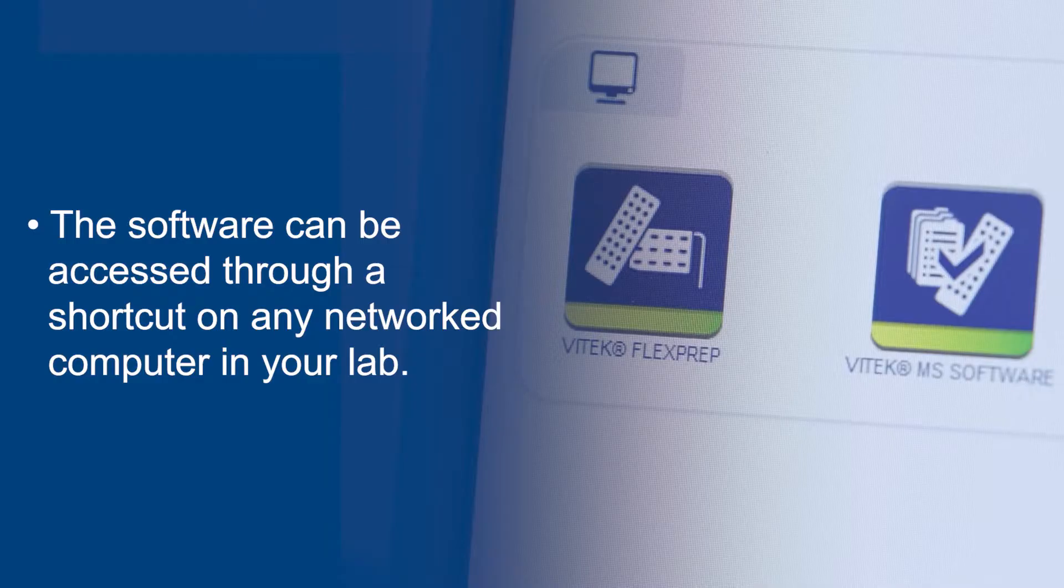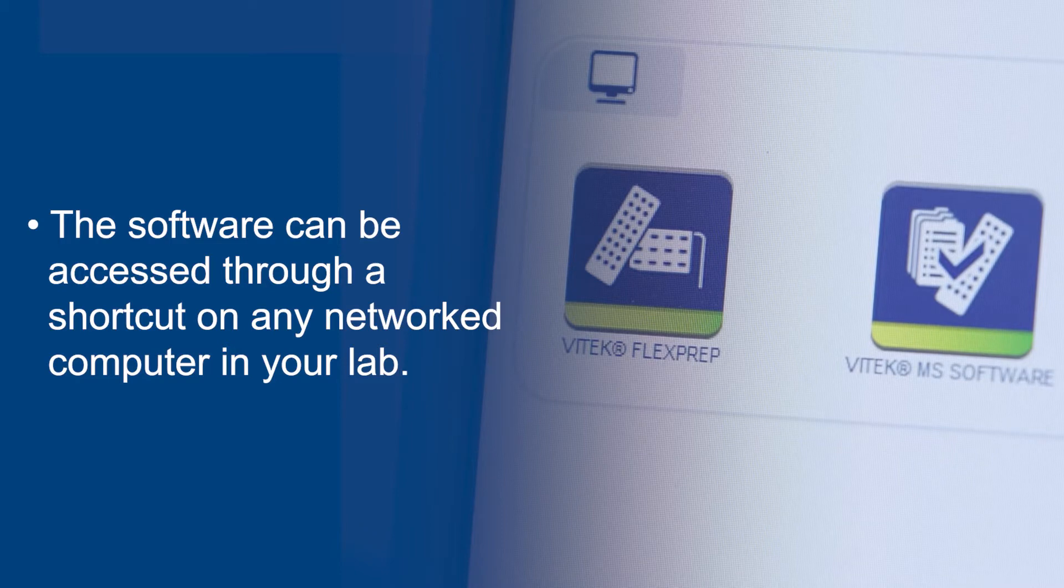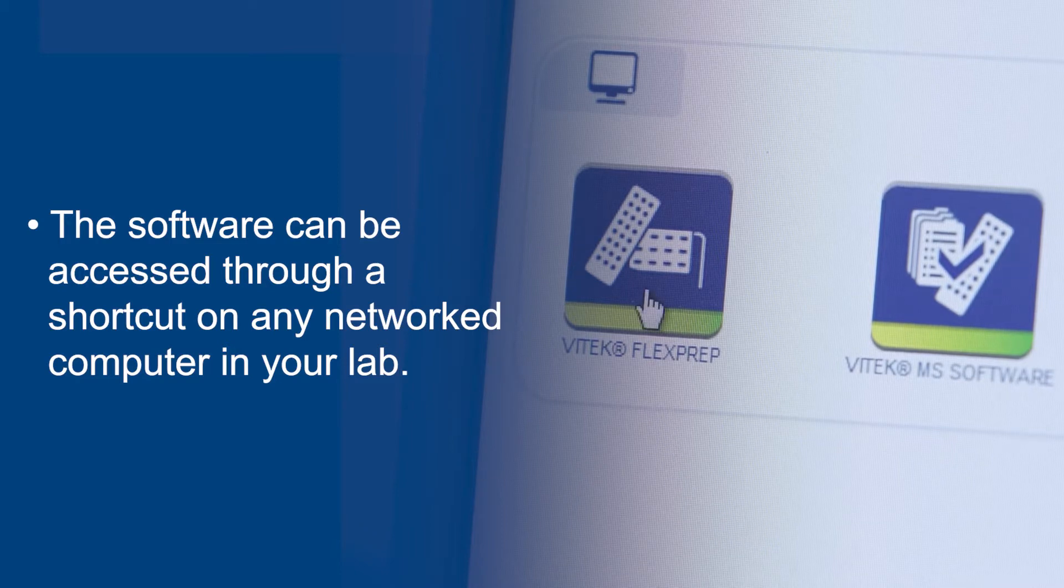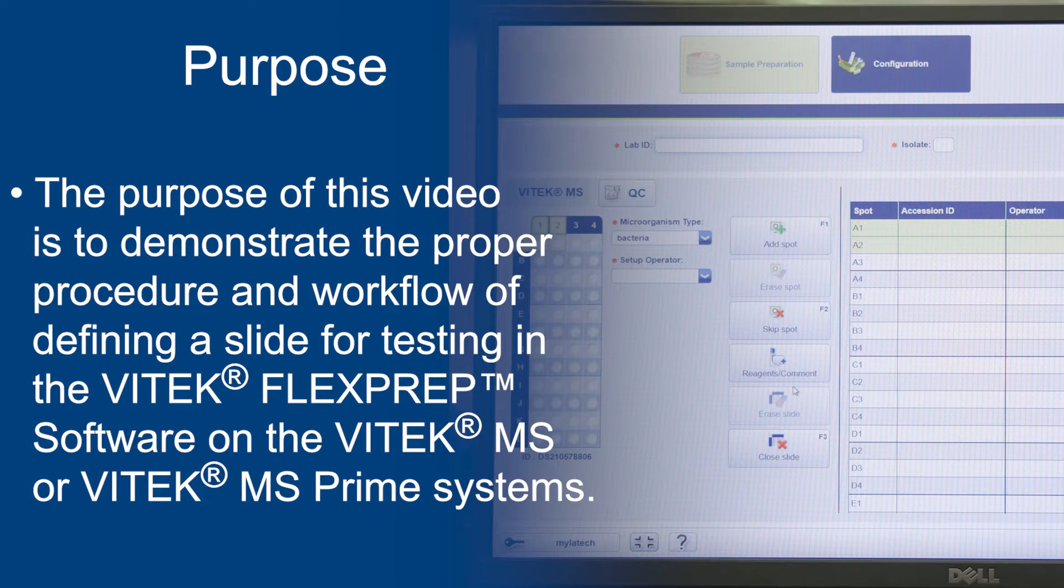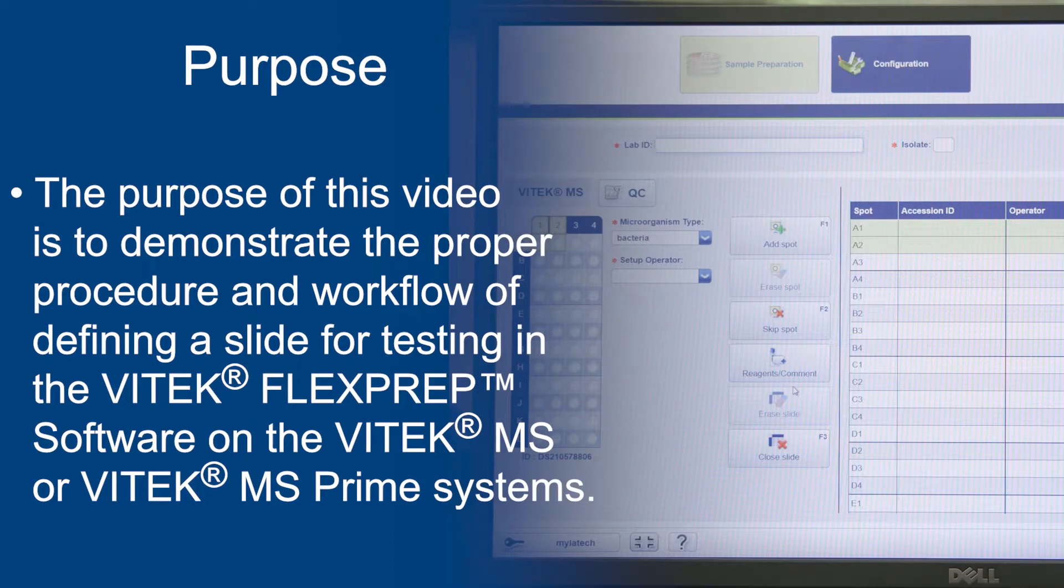The software can be accessed through a shortcut on any networked computer in your lab. The purpose of this video is to demonstrate the proper procedure and workflow of defining a slide for testing in the Vitec FlexPrep software on the Vitec MS or Vitec MS Prime systems.